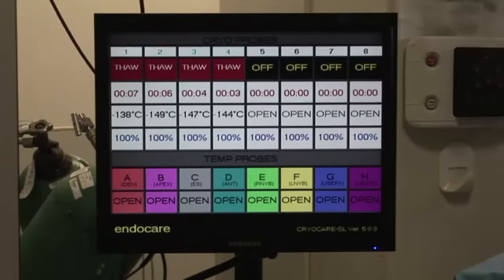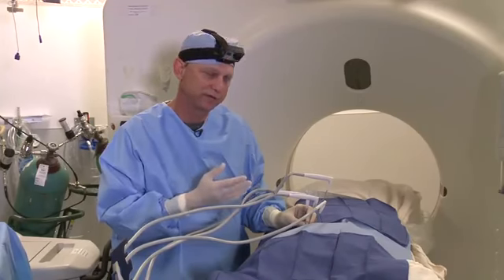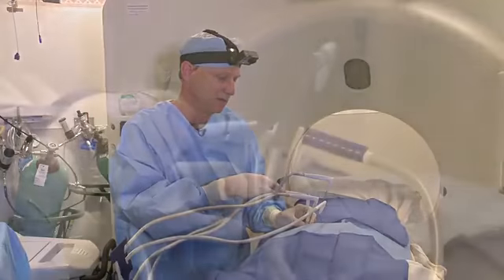So our second freeze is complete at 8 minutes. We'll go to the thaw cycle now, just a straight helium cycle. And when the temperature of each probe is about 20 degrees above centigrade, we'll pop them out and do our final set of pictures and see how we've done. So the thaw cycle is complete. All of these probes are above 15, 20 degrees above zero.